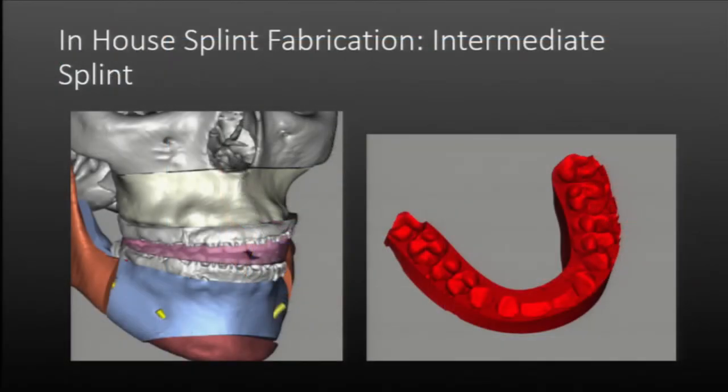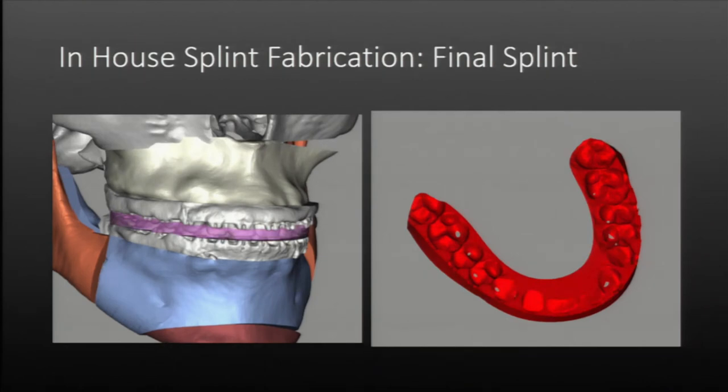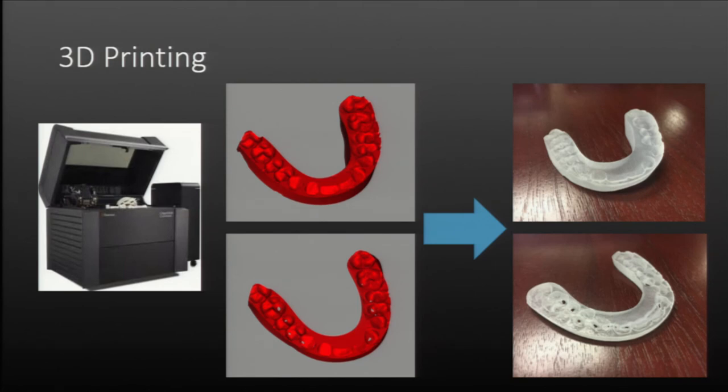Here I'm gonna cut the lower jaw before I fix the upper jaw deformity. So the upper jaw is in the original position, the lower jaw is in a new position, and the computer will create these wafers that relate the position of the lower jaw to the uncut upper jaw. And here, this is the final alignment. After the lower jaw is fixated in the final alignment, I cut the upper jaw, and this wafer will tell me exactly where to put it. And we 3D print here in our own lab, and those things are sterilized at the surgery.